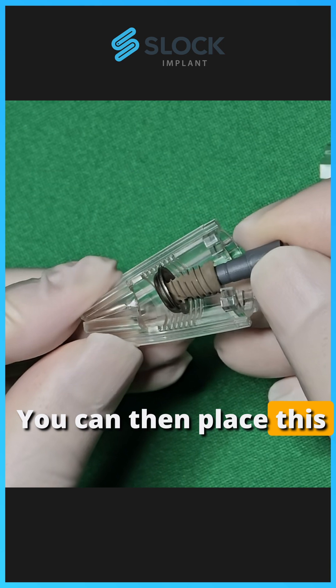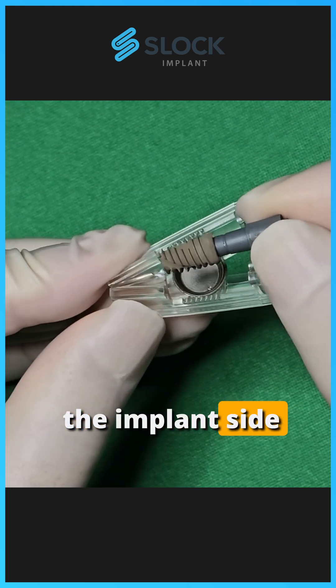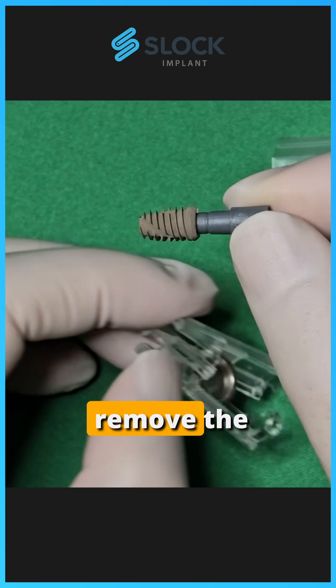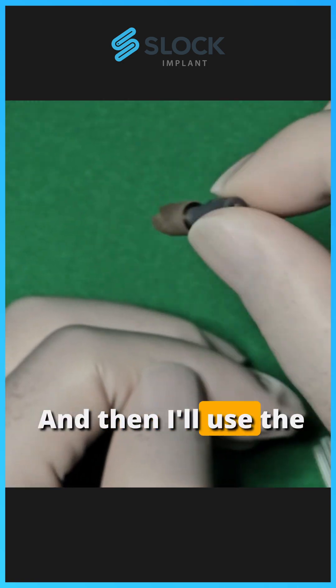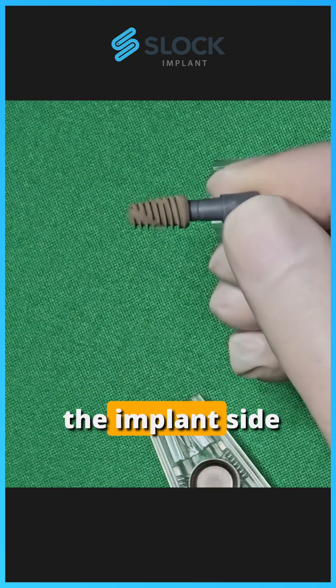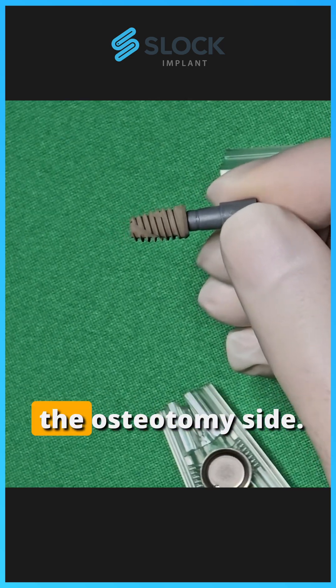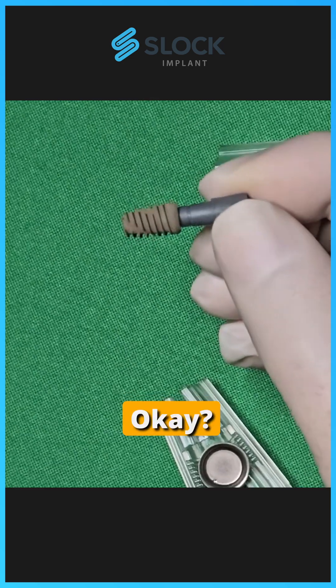You can then place this fixture in the mouth at the implant site preparation side, perform a rotary insertion, and remove the healing plug. Then I'll use the fixture driver to drive the implant site preparation, so I can rotationally insert the fixture into the osteotomy site.